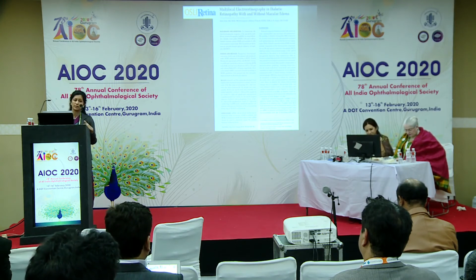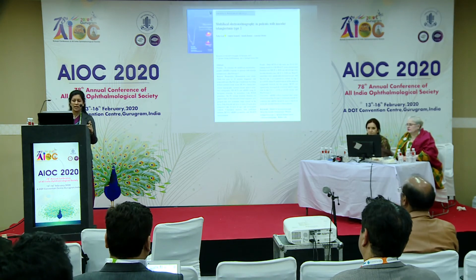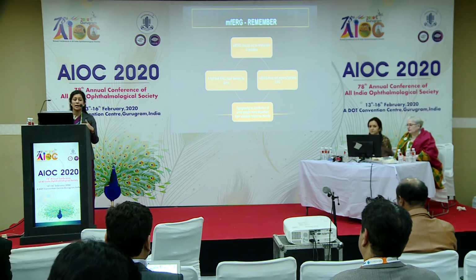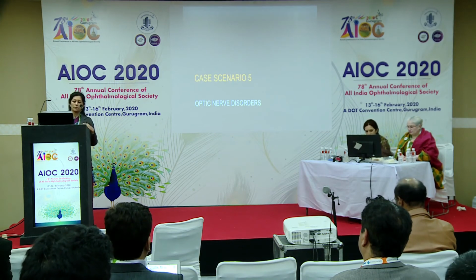We ourselves have done this study which has shown that there are defects or deficiencies on multifocal ERG independent of OCT, which may have future therapeutic implications as well. Again, in patients with MacTel, it does localize the defect to the bipolar cell layer. But please do remember that multifocal ERG should not be interpreted in isolation. A full field or pattern should also be done in accordance. Now, the final case scenario, optic nerve disorders.